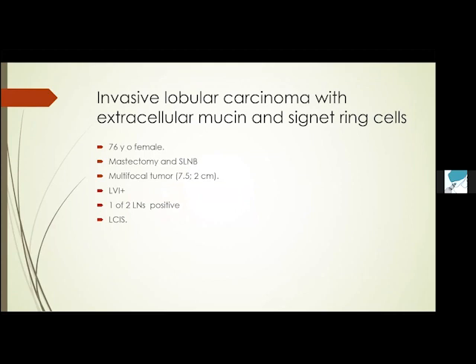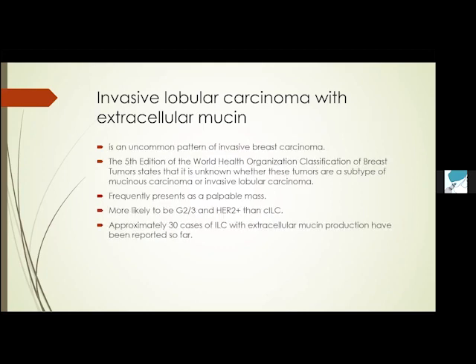To summarize, we have a tumor that is a nice example of invasive lobular carcinoma with extracellular mucin and signet ring cells in an elderly patient with multifocal tumor, positive LVI, positive lymph node. The patient also had areas of LCIS.